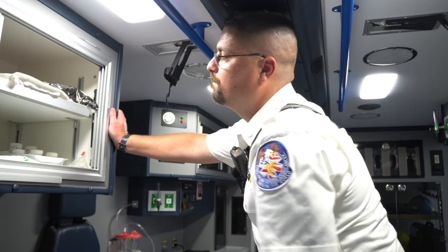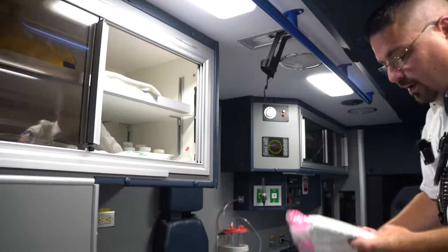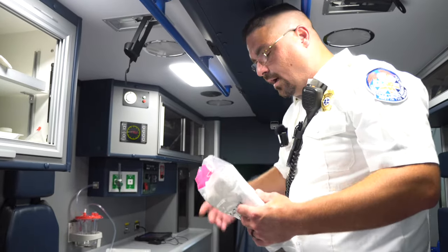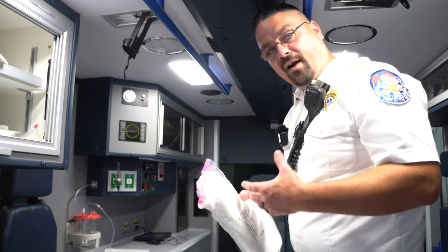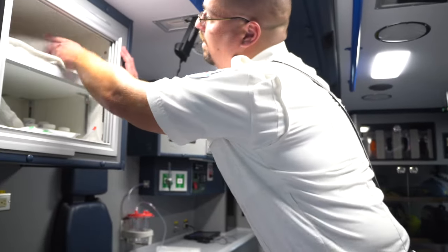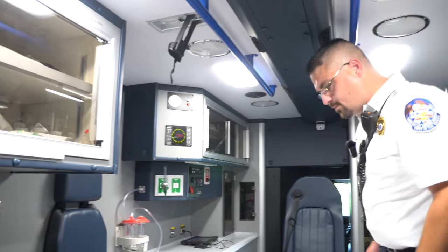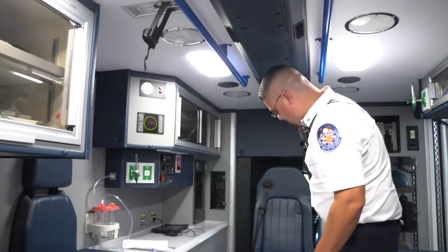Can you deliver babies in these trucks? We can — we have an OB kit with everything needed to deliver a baby: sheets, little bulb syringes to suction the baby's airway, and tools to clamp and cut the cord. Pretty much an ambulance is designed to handle any life-threatening emergency within the first ten minutes. We can bring life back or we can deliver life.